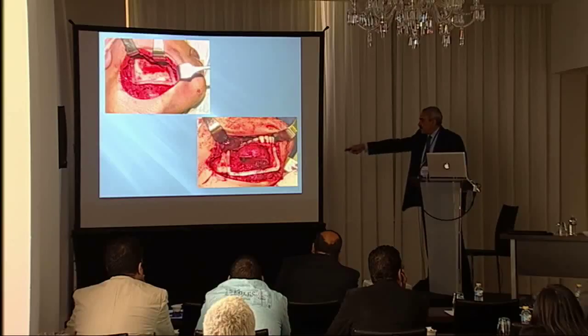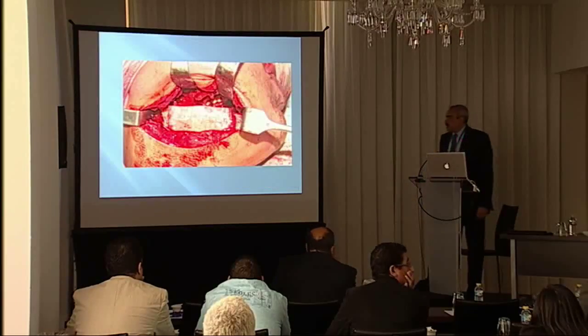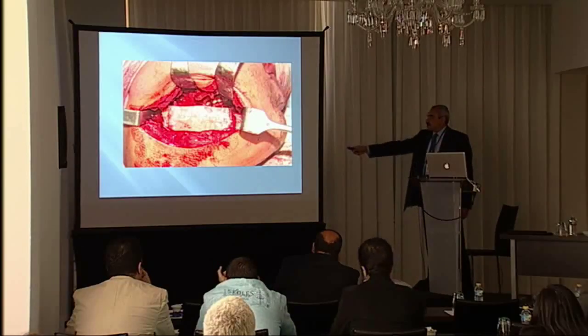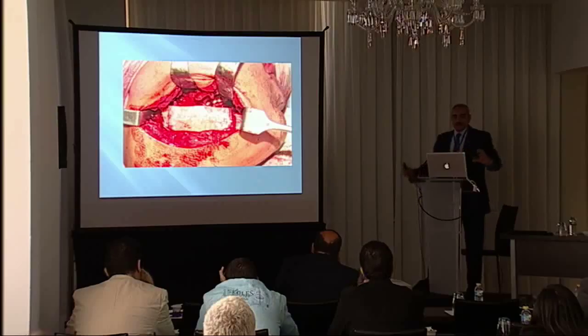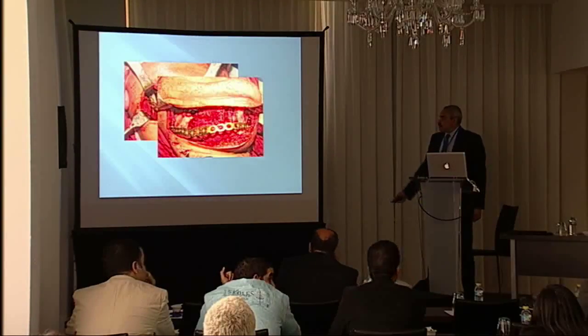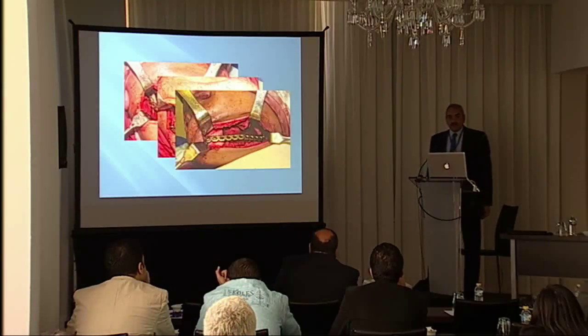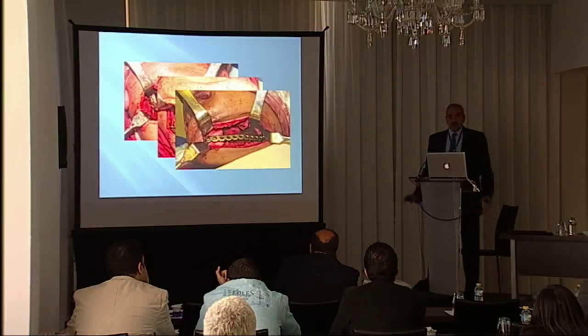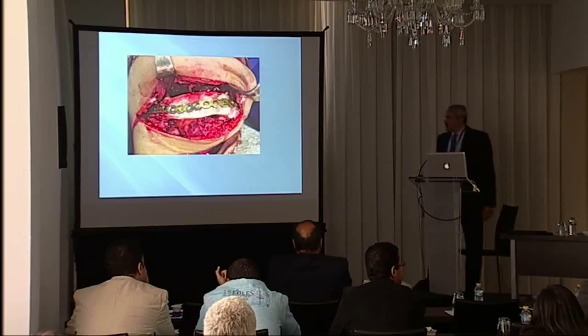Then we cut from here to there, so we cut exactly the same as we did on the modeling on the computer. This is the replica that we took from the other side, and it helps to position the segments together, and then we start placing the reconstruction plates. I can assure you that all the reconstruction plates were fitted in place very well with almost no adjustment. The technique is extremely sensitive and accurate.